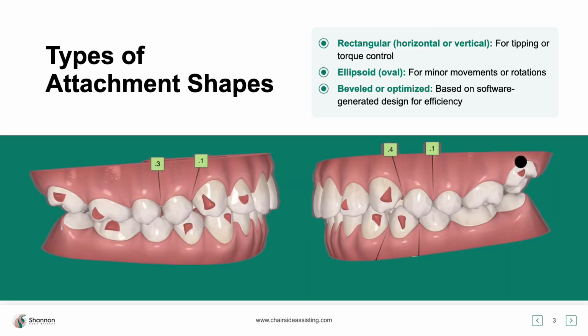Our main focus is really taking you through how to place those attachments and, most importantly, making sure that you do them correctly. I've delivered at this point in my life thousands of attachments, and I've taught over 60,000 dental team members, and I know firsthand that not everything we do is right. So I'm going to share with you throughout this program the good and the bad, okay? And that's something that's really, really important.